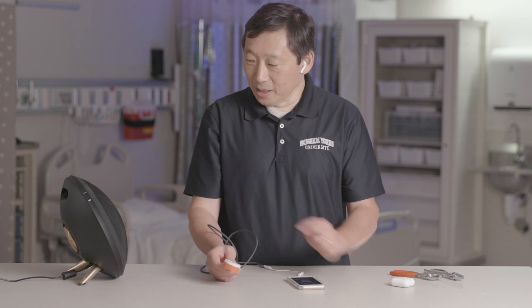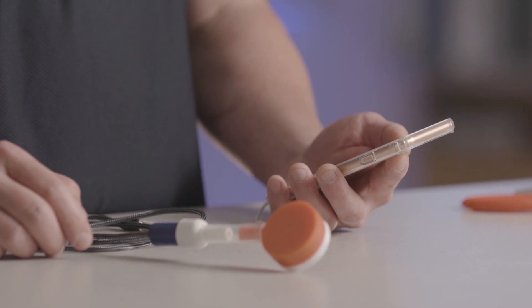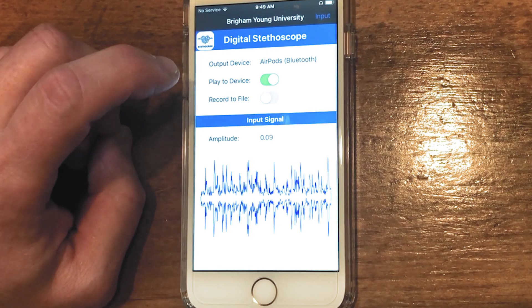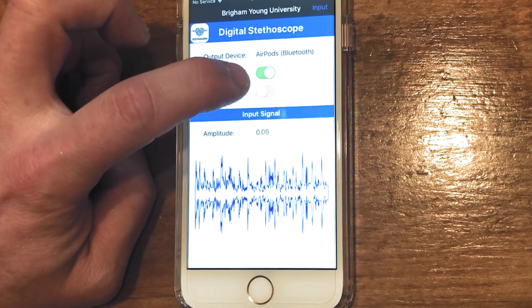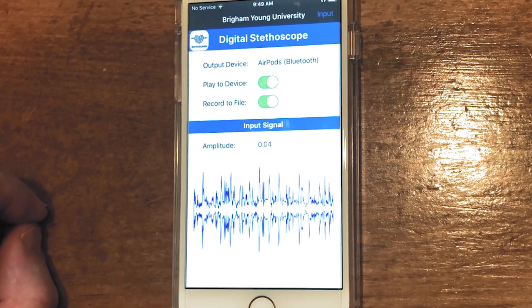And you start the app and you can start listening to your heartbeat. Let's try playing into the speaker — I'm going to play the sound that we just recorded. You can take this digital signal and either archive it as a sound file or stream it in real time to a listening physician or nurse practitioner on the other side.